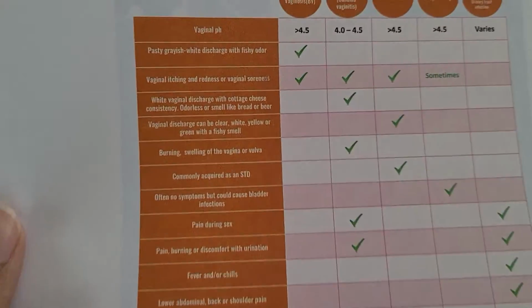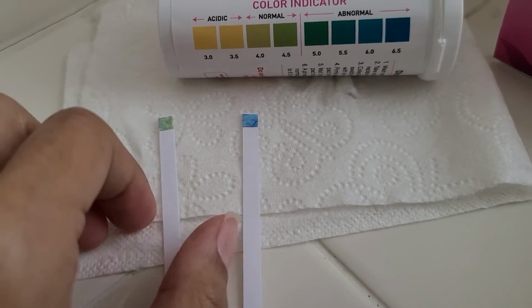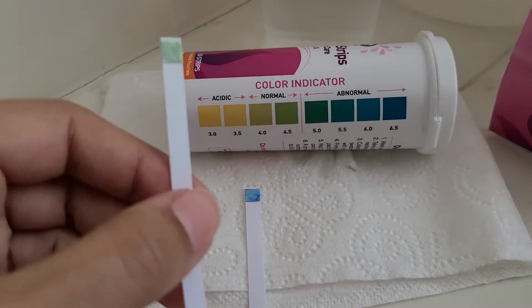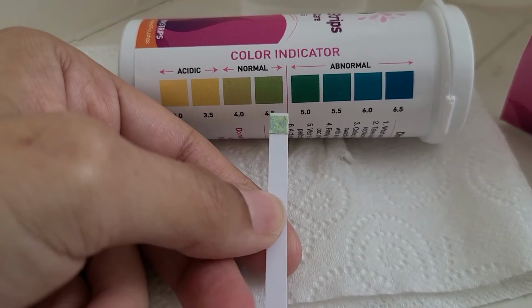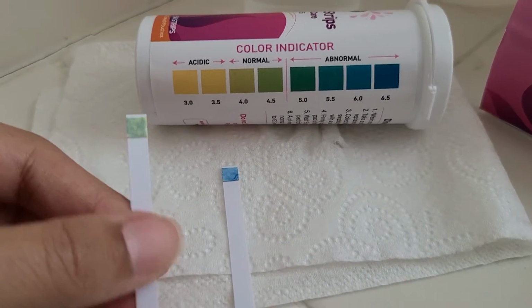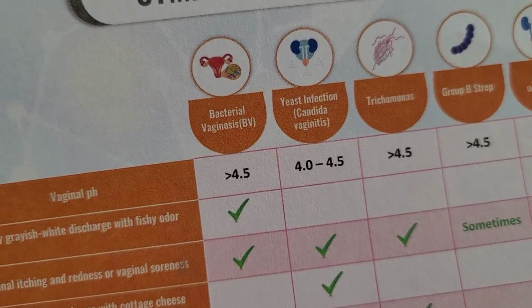The second thing that you want to look at is your vaginal pH value, and this is what we're going to use the strips for. When you do your vaginal testing and take the swab of your vaginal secretions and put it on the strip, you're going to compare the value to the color chart. If you get a value that's in the 4.5 range, this is the normal range. That value is most likely consistent with a yeast infection, as you can see in the chart here.